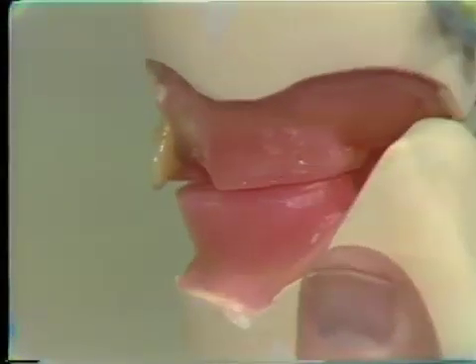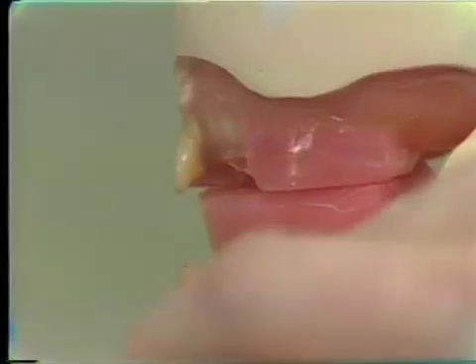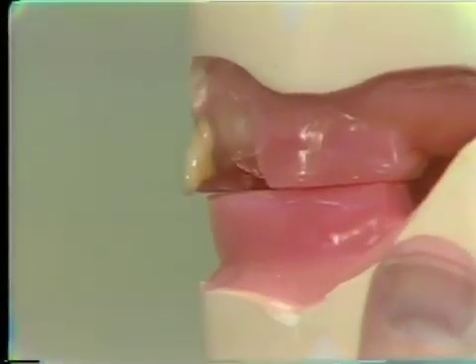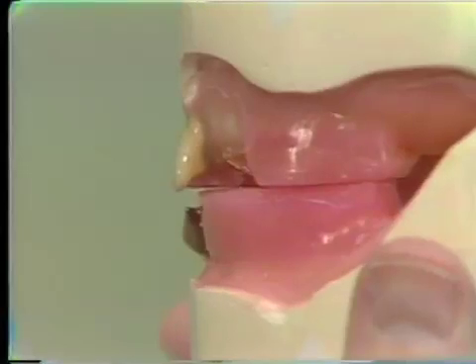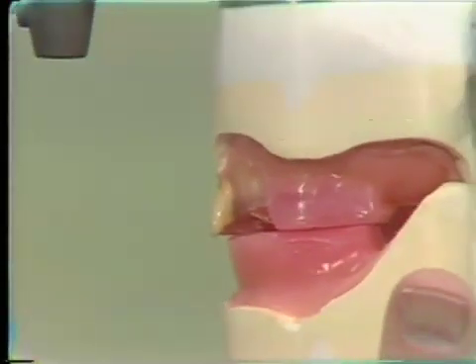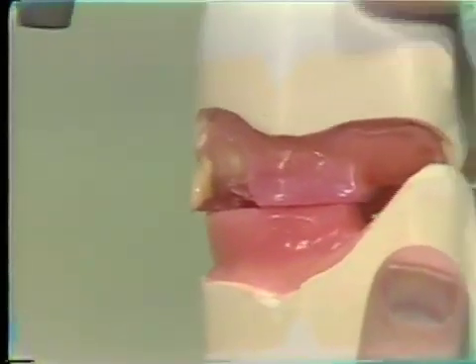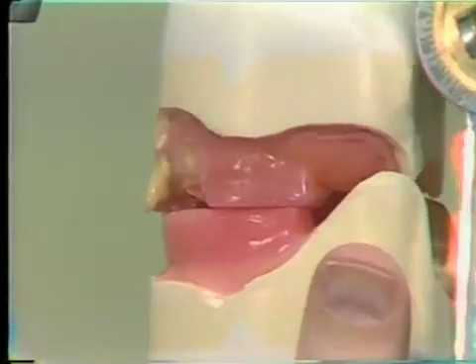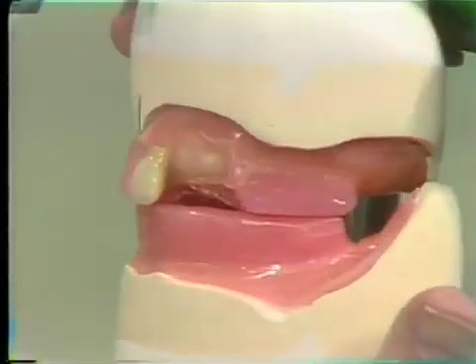Now as I turn the articulator around, another item that I'd like to point out is that you can see some developing horizontal overlap. This is what we talk about as overjet. And when the lower teeth are set where the wax rim now exists, we will develop this millimeter overjet. 1 millimeter overbite, 1 millimeter overjet.